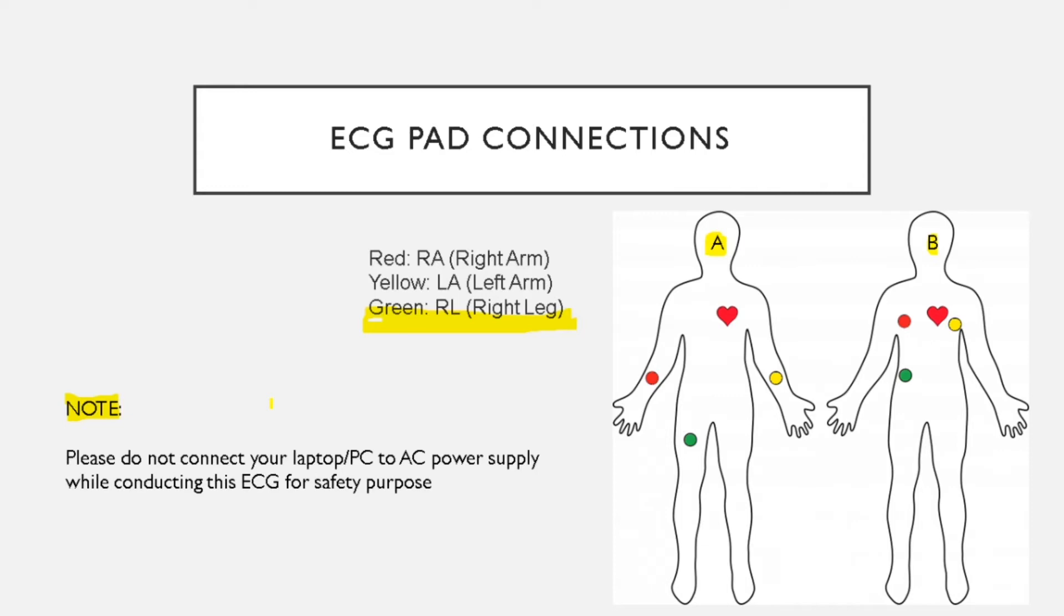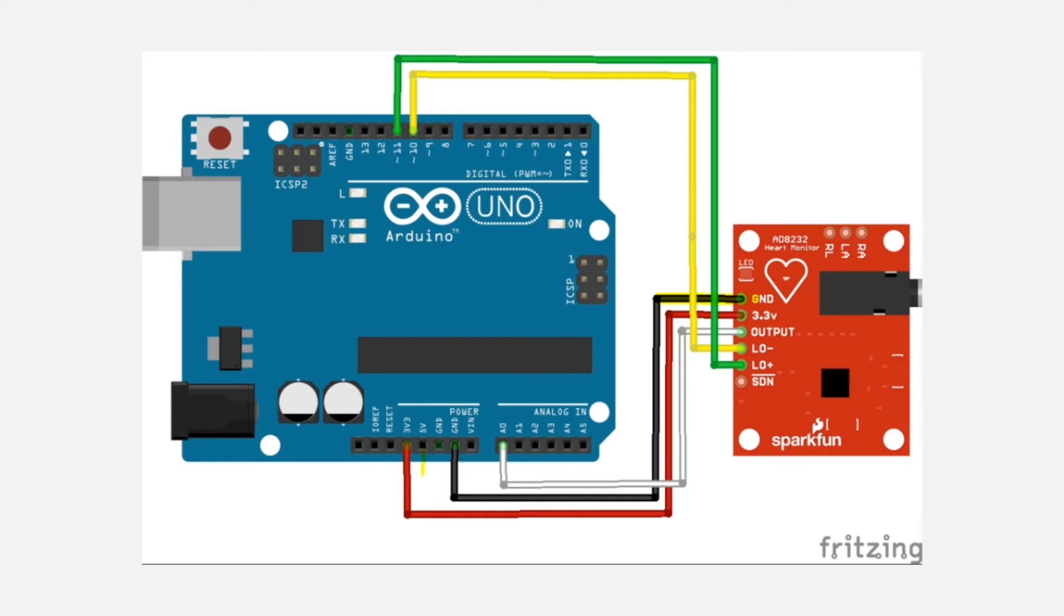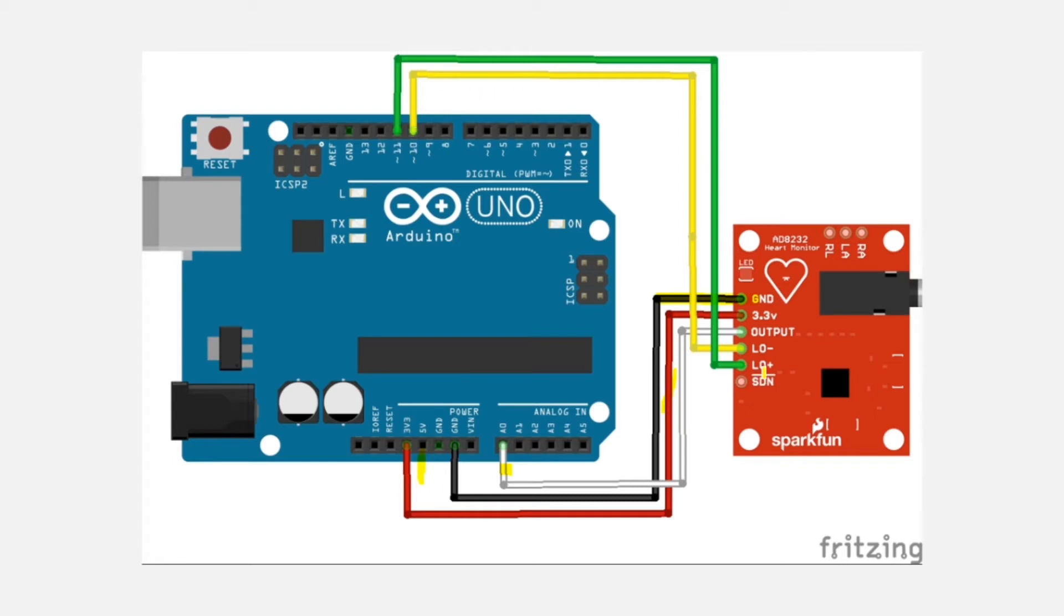This is a circuit diagram. The ground is connected to the ground of the Arduino. The 3.3 volts is connected to the 3.3 volts of the Arduino. Make sure not to provide 5 volt supply, otherwise it's gonna damage the module. The output is connected to analog pin of the Arduino. The LO minus is connected to digital pin 10 and the LO plus is connected to digital pin 11.